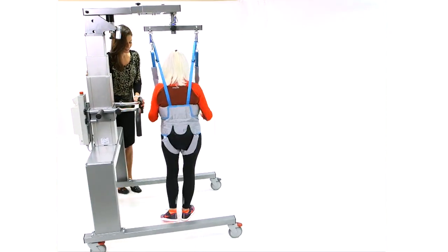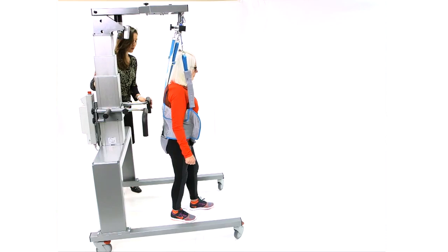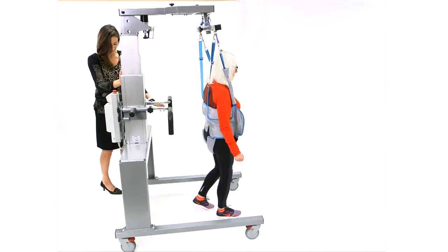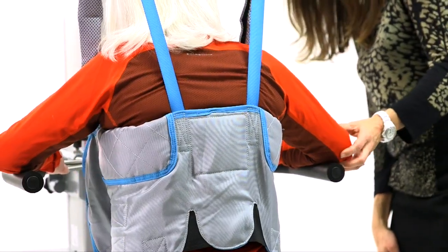The Physiogate's variable unweighting can be utilized in a variety of balance and gait therapies, such as mini squats.